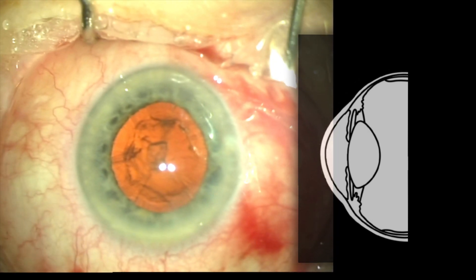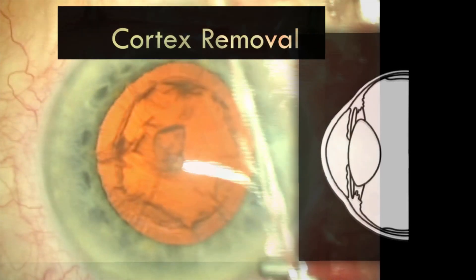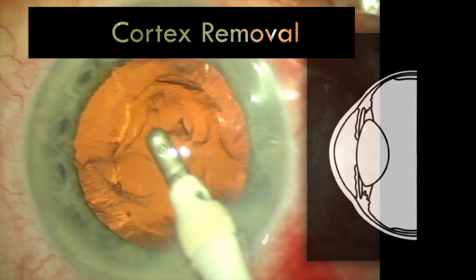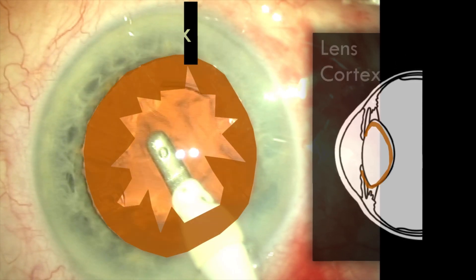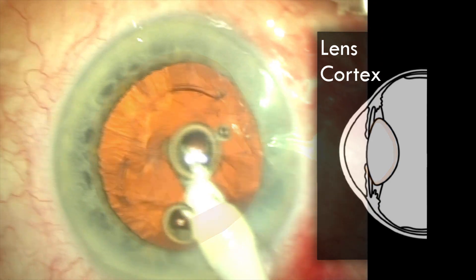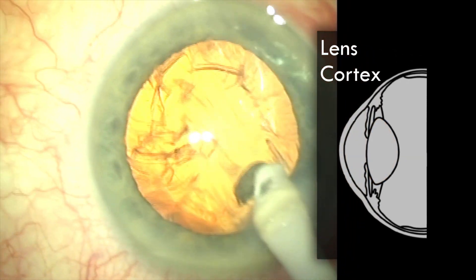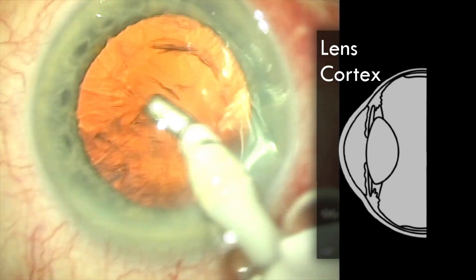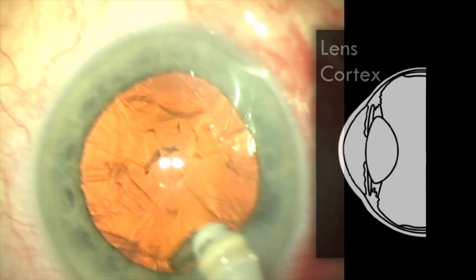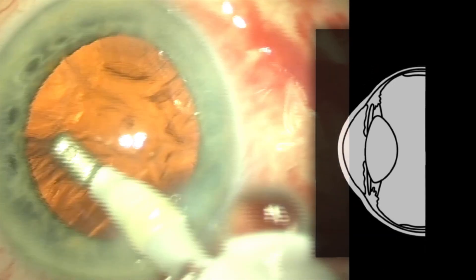Now that the bulk of the cataract has been removed, you can see that the red reflex is already significantly brighter. There's still some outer lens cortex that needs removing, and I'm using the irrigation and aspiration probe to remove it. I'm engaging the cortex, bringing the probe into the centre, and using the vacuum to peel away the cortex matter.